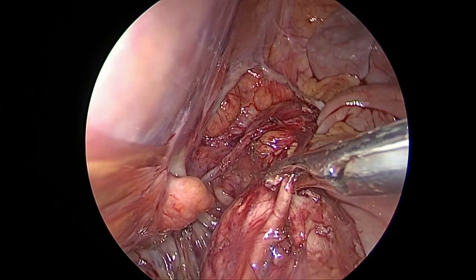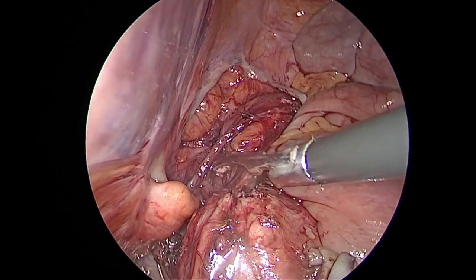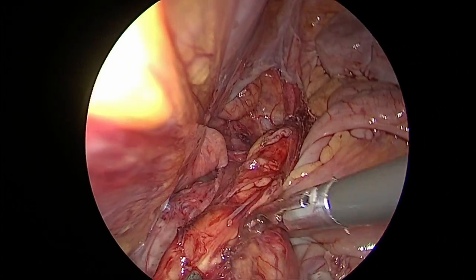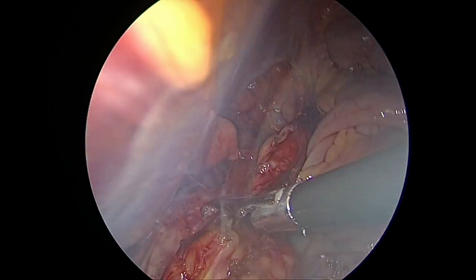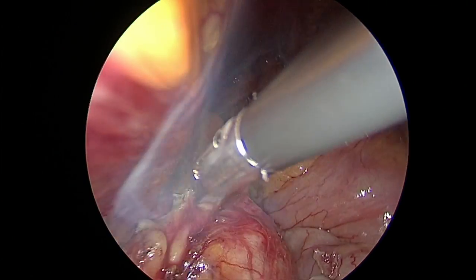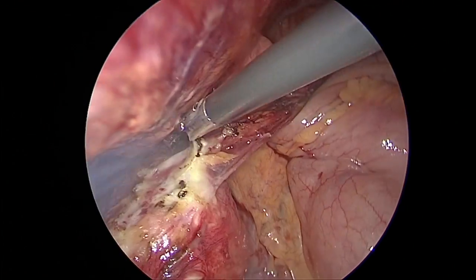What I did was I coagulated the lymphatics on either side and then cut in between so that we don't have any leak. So once the cyst was well dissected, what I did was I put the cyst in a sterile endobag and remove the cyst.